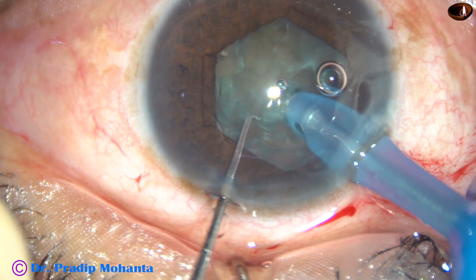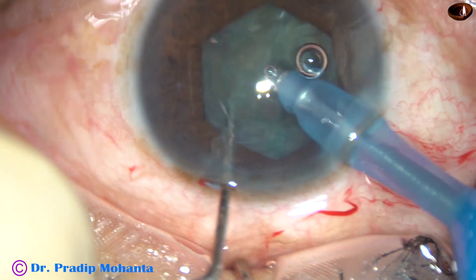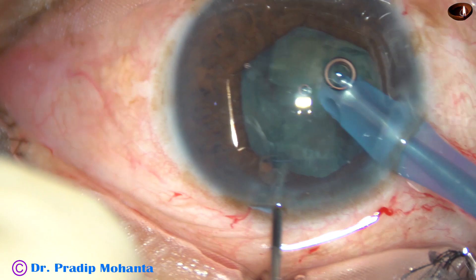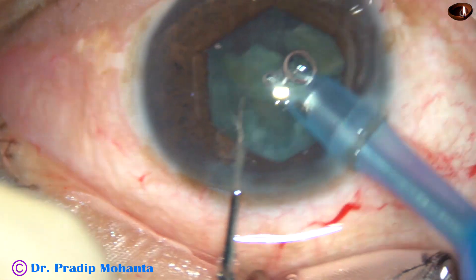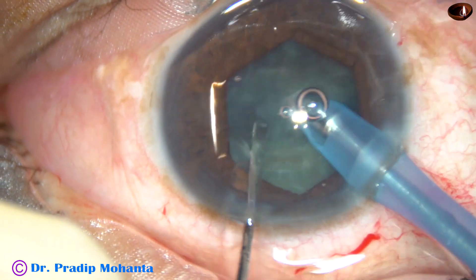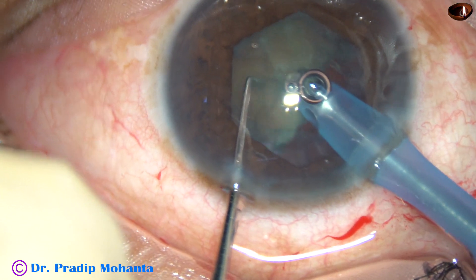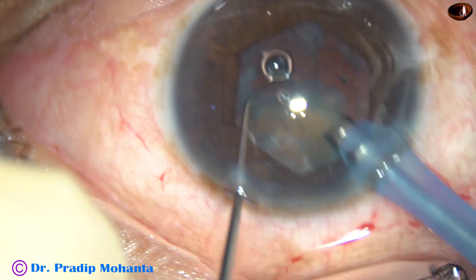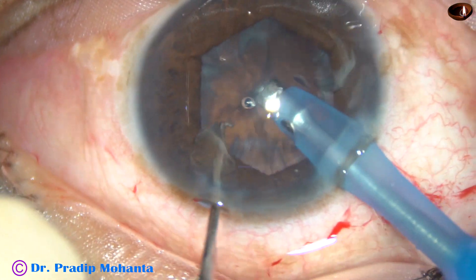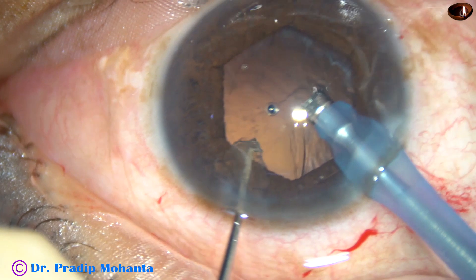Now I turn the handpiece, make the bevel up and I'm going to do a direct chop. Bury the tip into the substance of the nucleus, hold the nucleus firmly and chop it. Rotate, hold it at another place and chop it again. Nucleus sclerosis in this case is about grade two plus and it is not easy to hold this nucleus. You have to use very low ultrasonic energy and moderate vacuum.